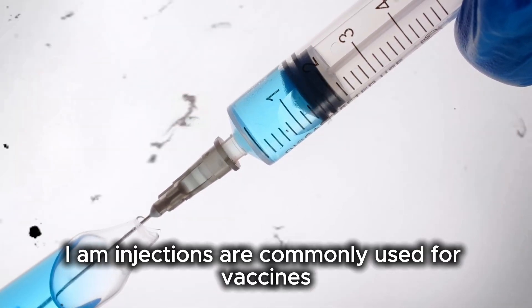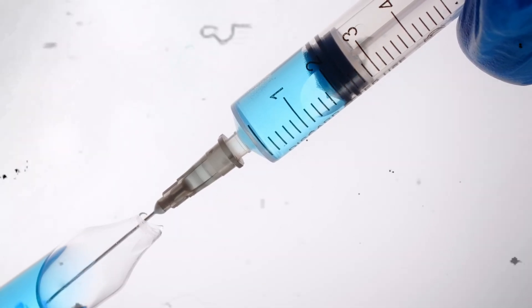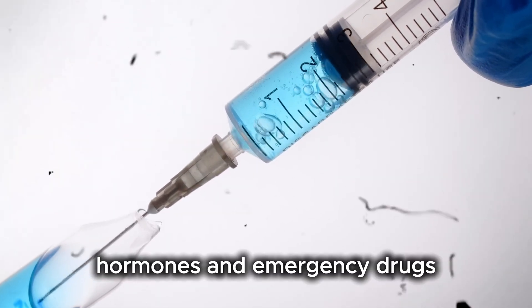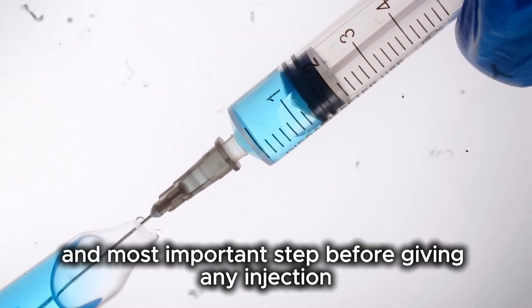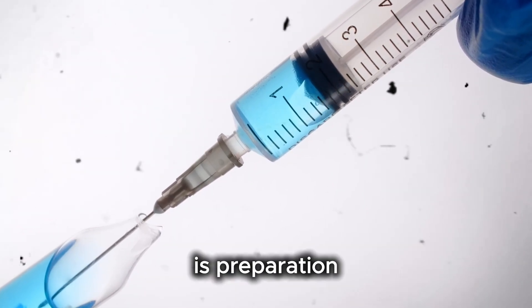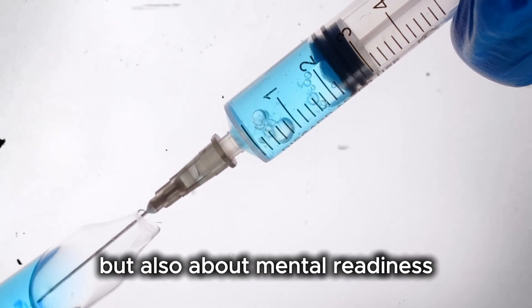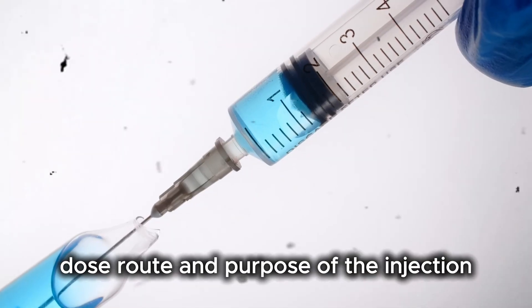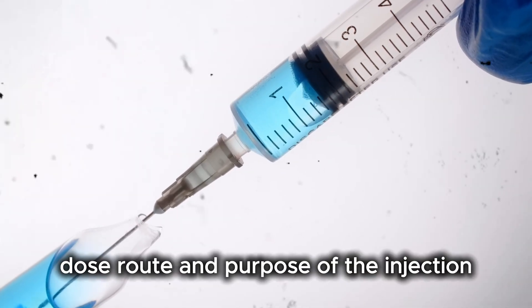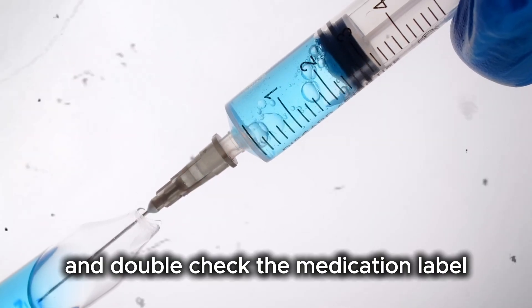IM injections are commonly used for vaccines, antibiotics, pain medications, hormones, and emergency drugs. The first and most important step before giving any injection is preparation. Preparation is not just about collecting equipment, but also about mental readiness. You must know the drug name, dose, route, and purpose of the injection. Always read the prescription carefully and double-check the medication label.